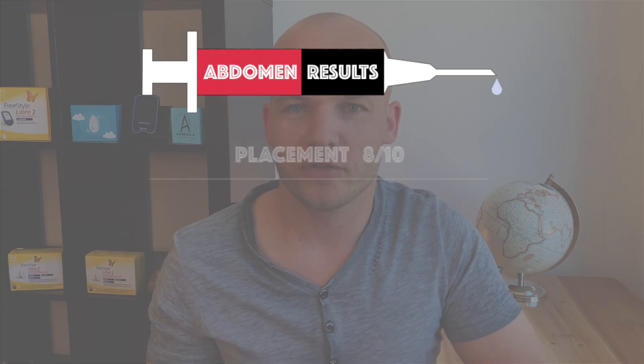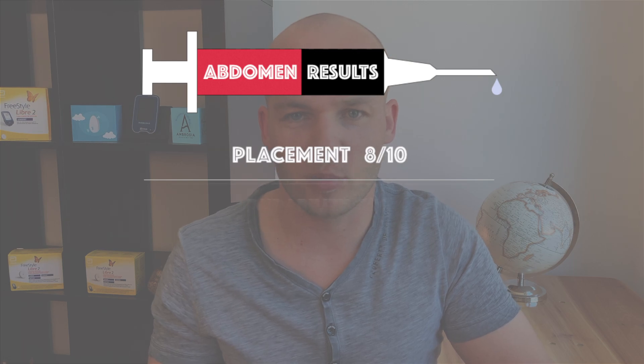I can imagine placing the sensor on your back would be a bit more challenging. As a friendly reminder: don't put the sensor in your muscle because that would be painful, and try to avoid spots where you typically apply insulin because that could negatively impact Libre accuracy. I gave the abdomen only 8 out of 10 points for placement because the area is less flat compared to an arm or a thigh. So not perfect, but good enough.